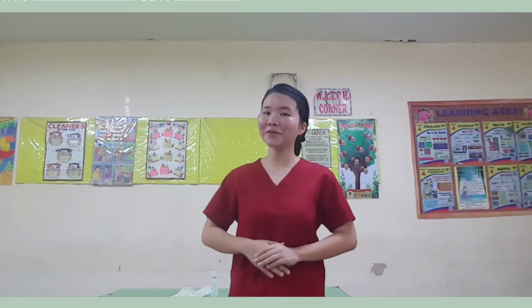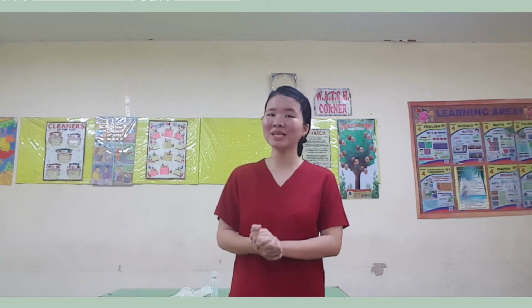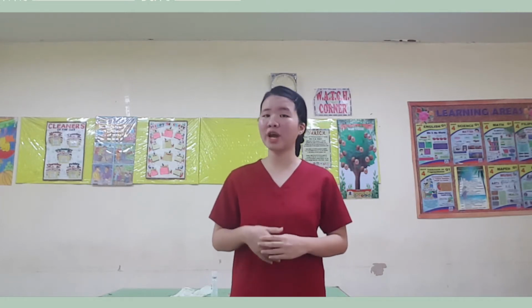Myla Joy Sigantoha, first-year nursing student at Central Mindanao University, and today I am going to demonstrate the procedure for mixing insulin and administering subcutaneous injections. But before that, we're going to do an assessment, which is to assess the patient for any allergies.